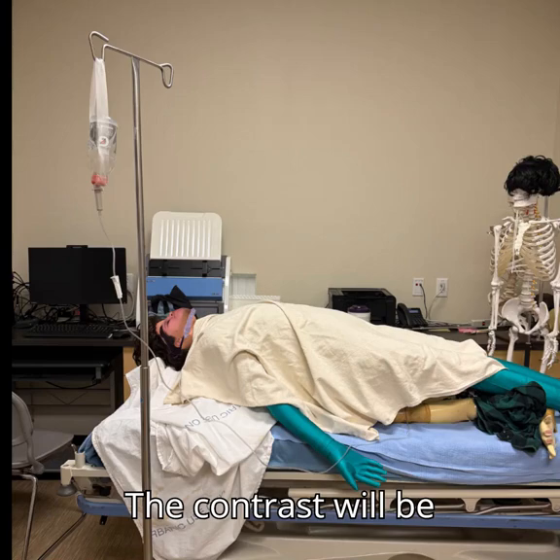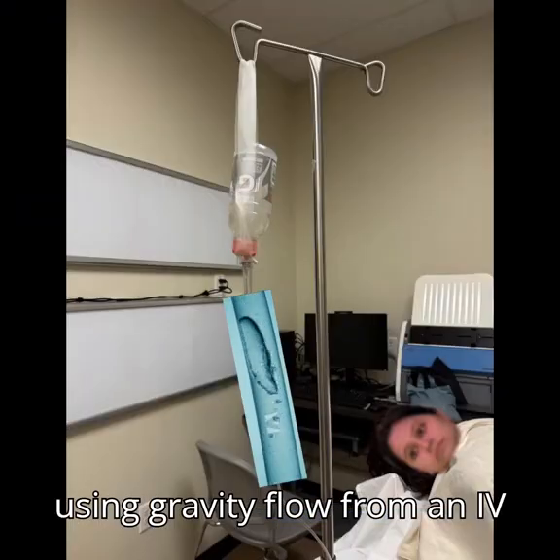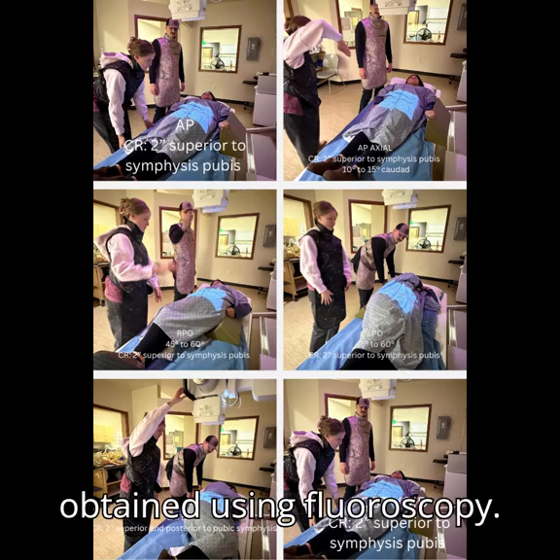The contrast will be administered through the catheter into the bladder using gravity flow from an IV pole. After the bladder is distended by contrast administration, images will be obtained using fluoroscopy.